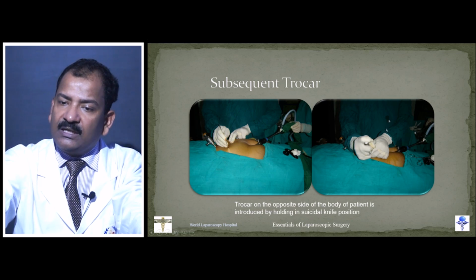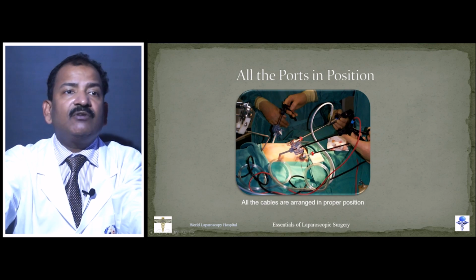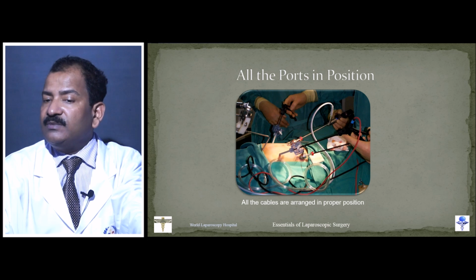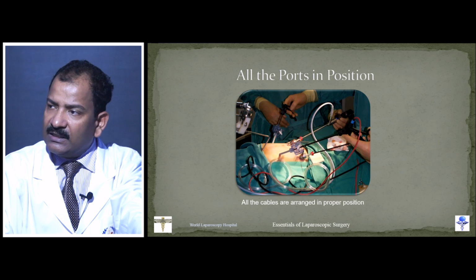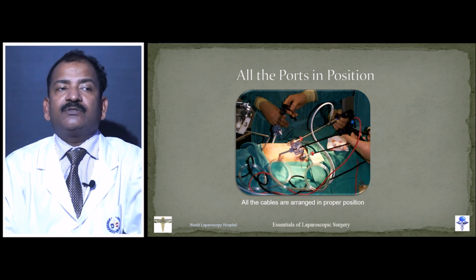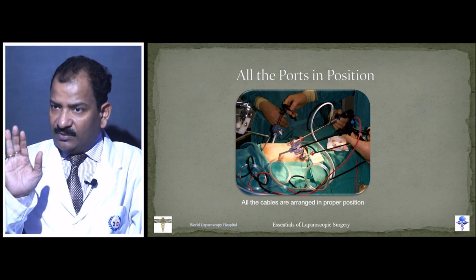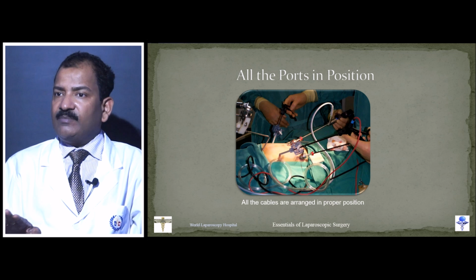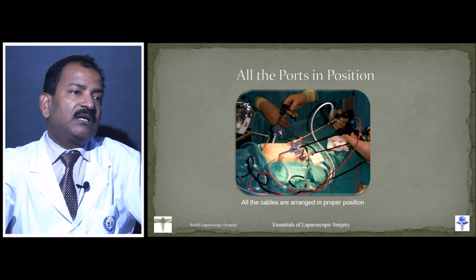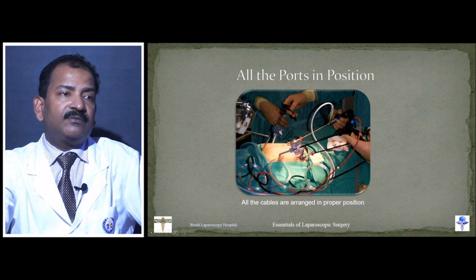Now, you will put the trocar and after that you will start putting your cables. When you are attaching your cables, you must take care that the camera cable and the monopolar or bipolar cables are not intermingled with each other. Otherwise, whenever you press the electrosurgical pedal, the monitor will flicker. So this must be taken care of, and the camera cable should be kept away.